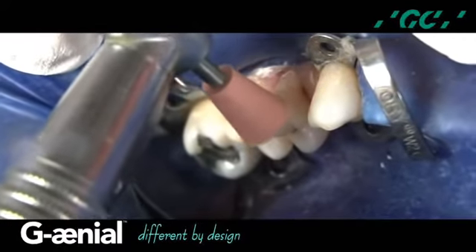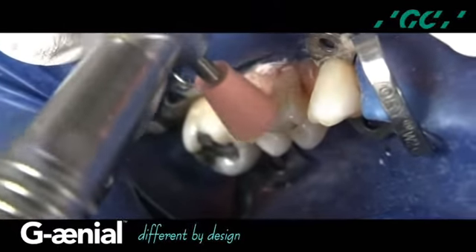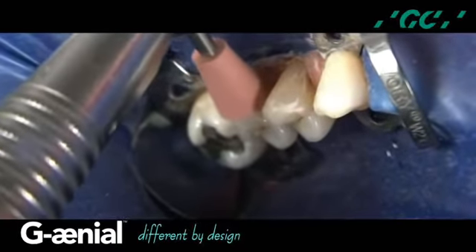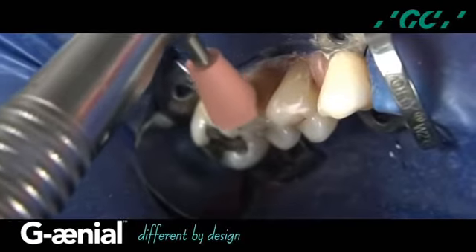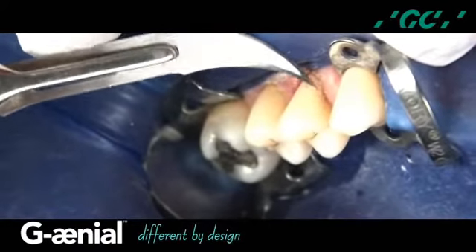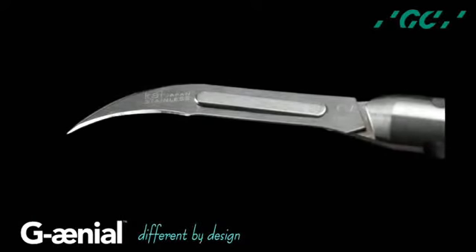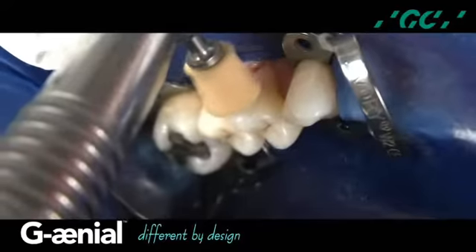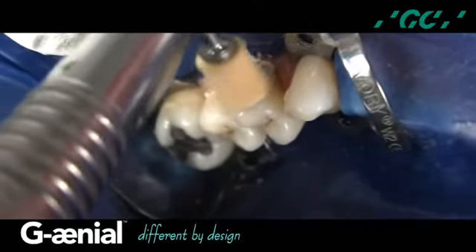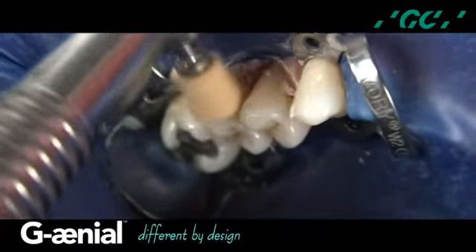Initial polishing is accomplished with a rubber hollow cup, which allows any surface defects to be effectively eliminated. This hollow cup provides additional flexibility for the curvature of the premolars. Any excess polymerized resin material is removed from the interface using a number 12 BD Bard Parker scalpel blade. A high luster is accomplished using a loose abrasive diamond composite polishing paste with an enhanced synthetic foam cup and a small amount of water.